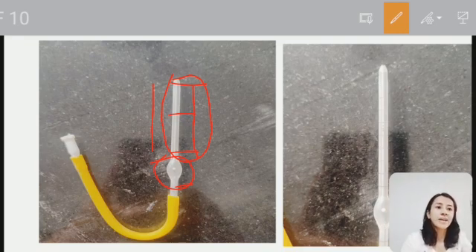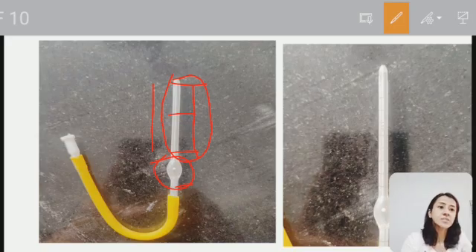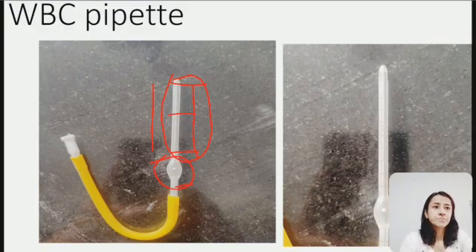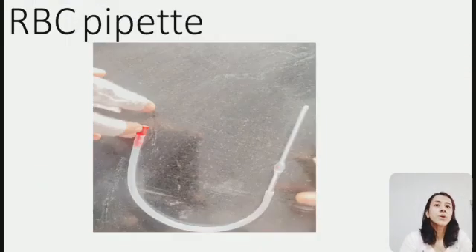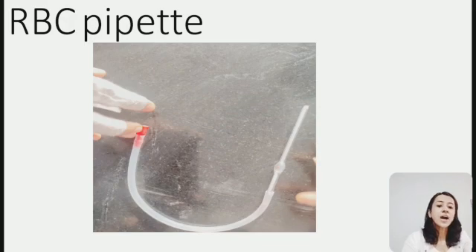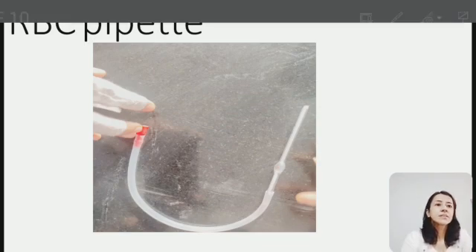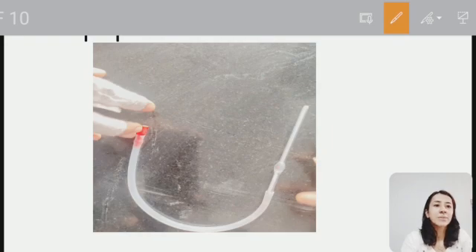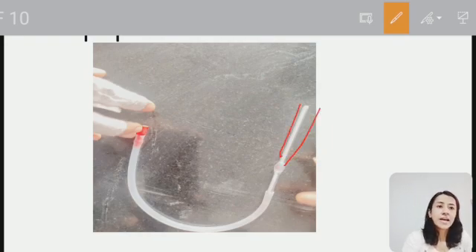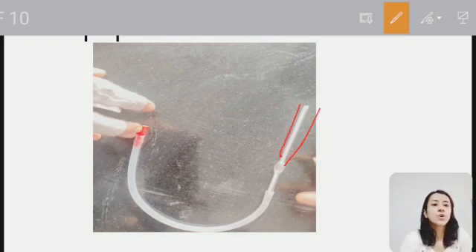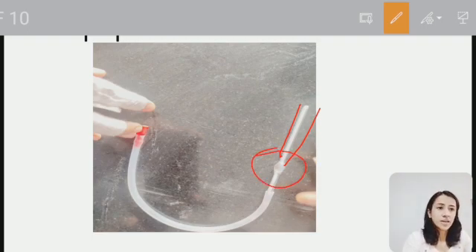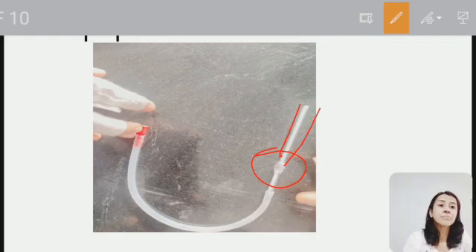Next is the RBC pipette. This RBC pipette also has a capillary tube, a stem, and a bulb. But the bulb is wider in the RBC pipette and it has a red bead inside. So you can differentiate the RBC pipette from the WBC pipette because it has a wider bulb and a red bead.